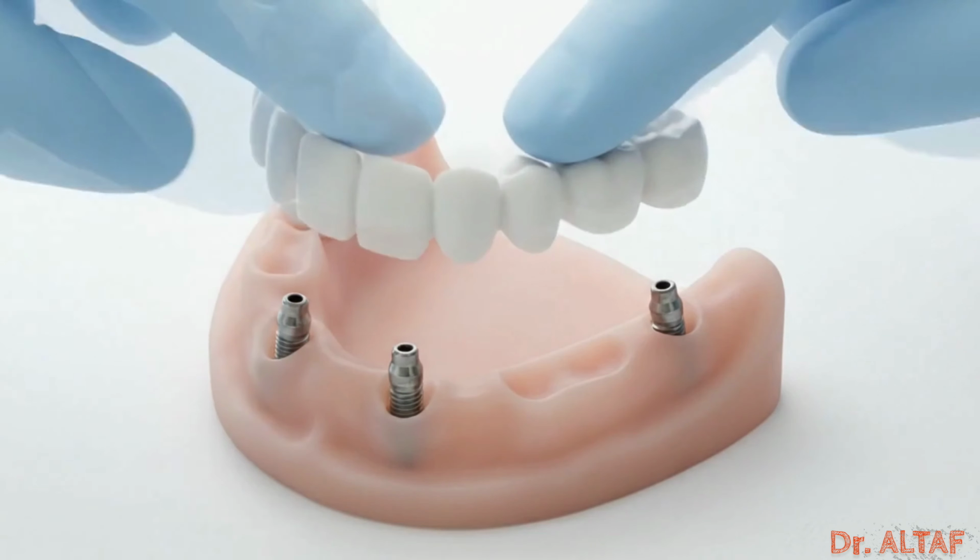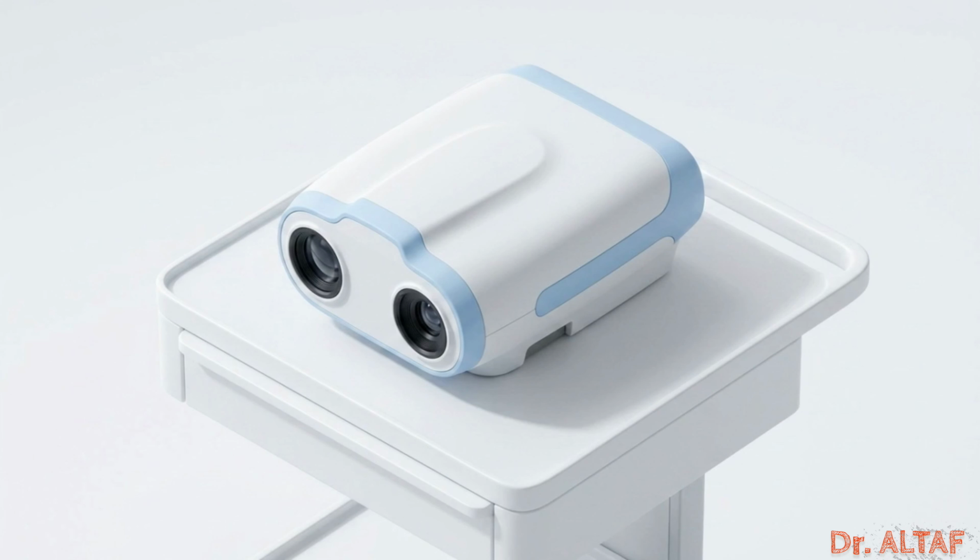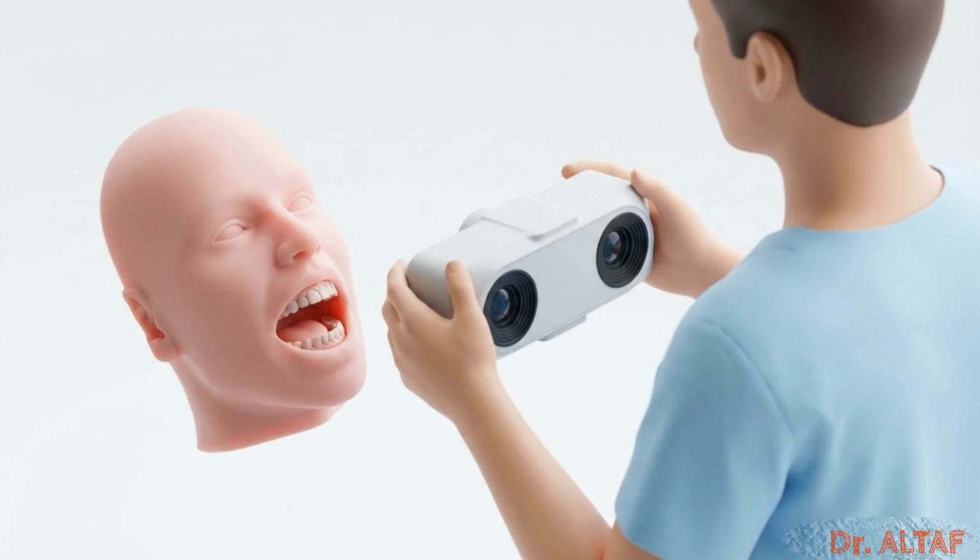To bypass the failure of surface scanning, modern digital dentistry utilizes a specialized technology for complex all-on-X cases: photogrammetry. Photogrammetry separates itself from intraoral scanning physically. It operates on an extraoral camera positioned outside the patient's mouth. Algorithmically, it completely abandons the generation of a continuous surface mesh.